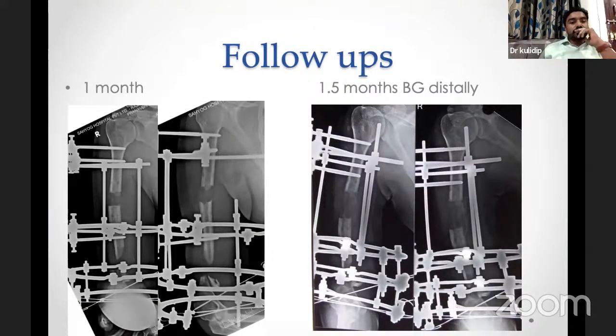And that's how it was done. I did a shaft corticotomy rather than a metaphyseal-epiphyseal corticotomy, but still it went with a good regenerate. I had used 3 wires in the last 2 ring block for the distal humerus.